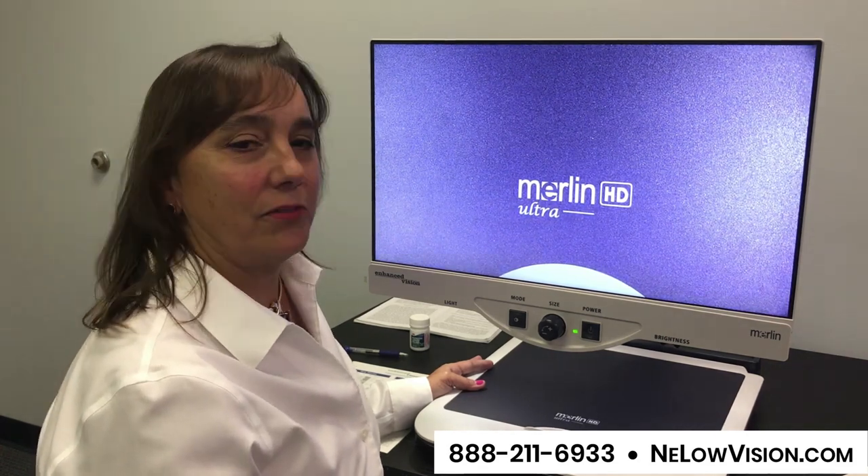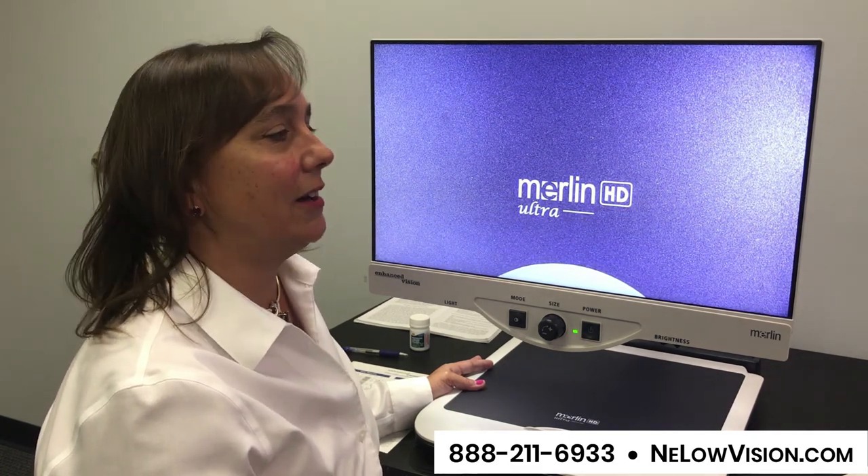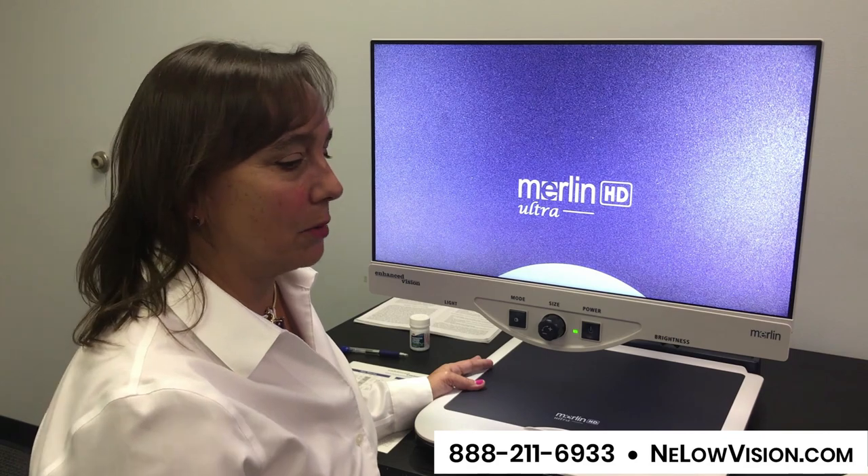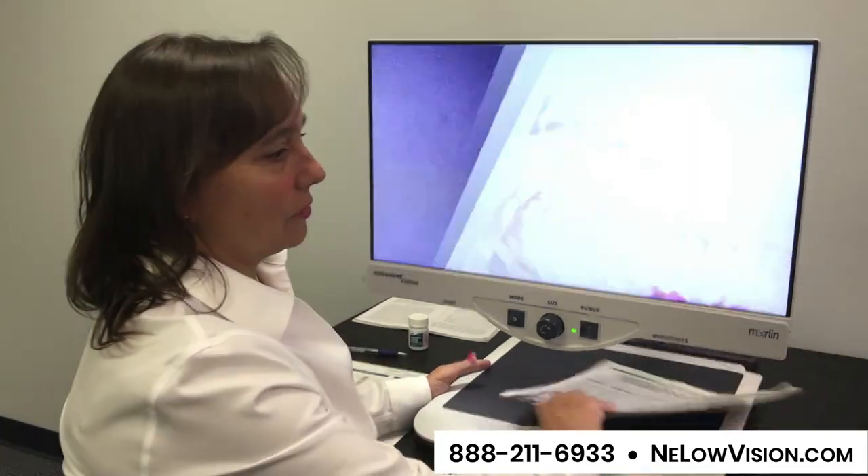I've used a device very similar to this through college and work. I also have macular degeneration, and it has carried me through and given me the ability to read and do just about anything. So I'm going to show you.